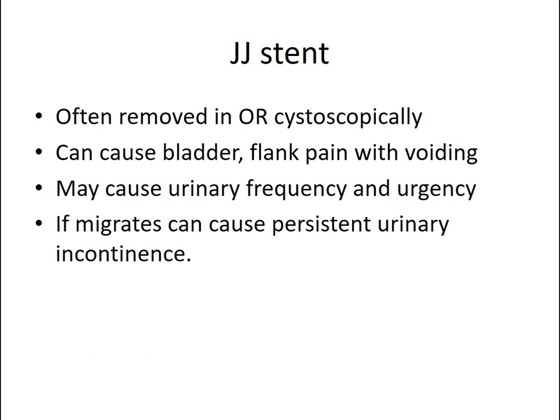We remove these often in the operating room cystoscopically on younger children. There is a string that's attached to it that in older children you can have exit the urethra and tape it to the legs. I've found when I talk to adolescents about that, the look I get is, no, thank you. But it can be done in the office for a more stoic adolescent.